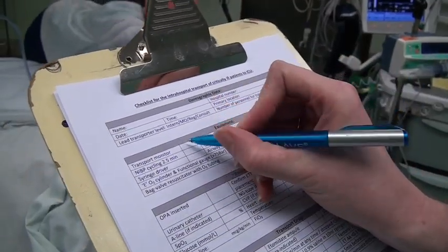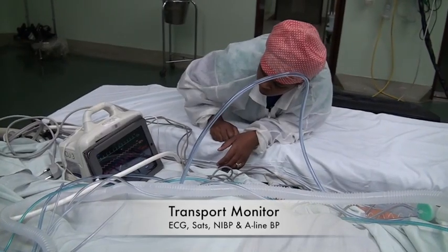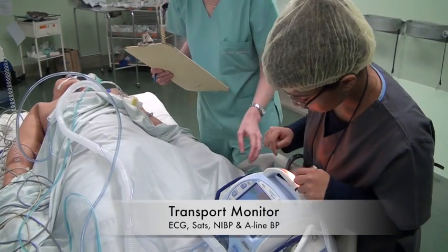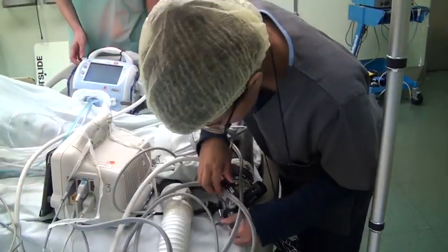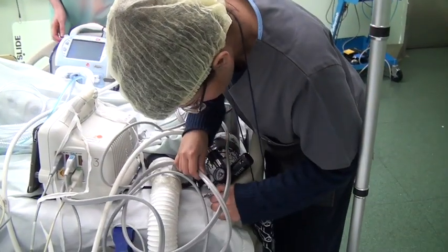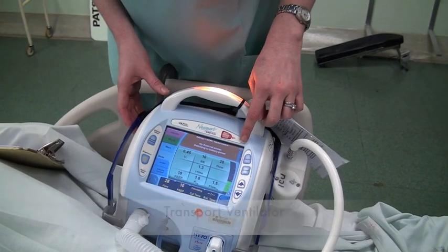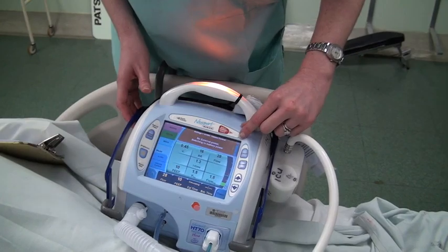We have our transport monitor set up with a sats probe, an ECG, NIBP, and our arterial line. It is on battery power and is 100% full.